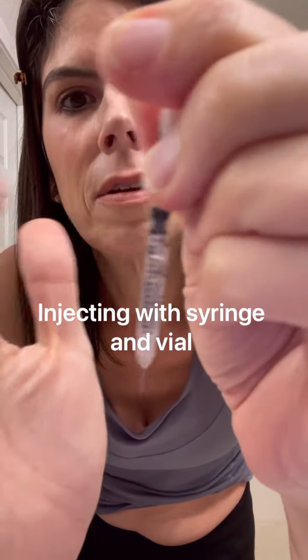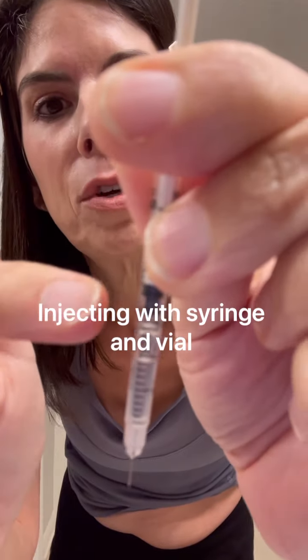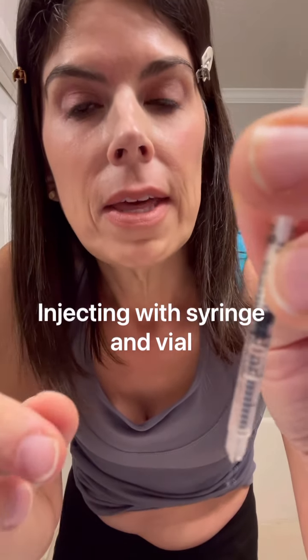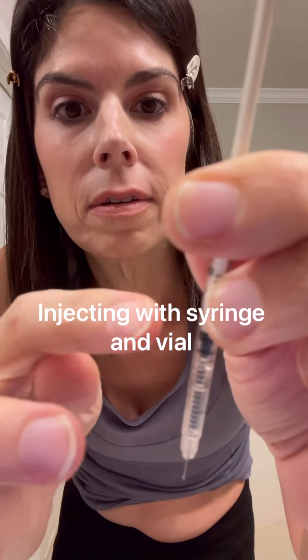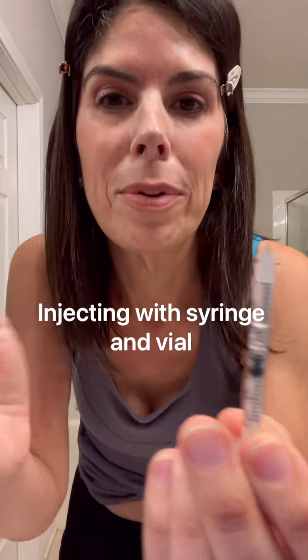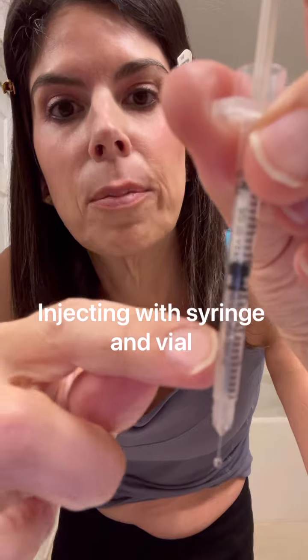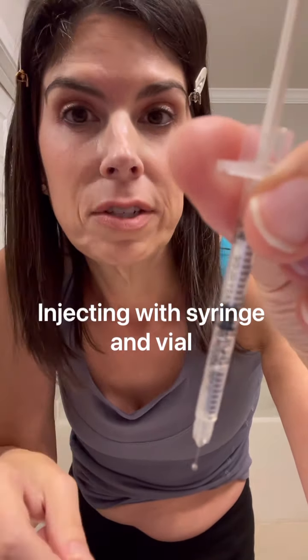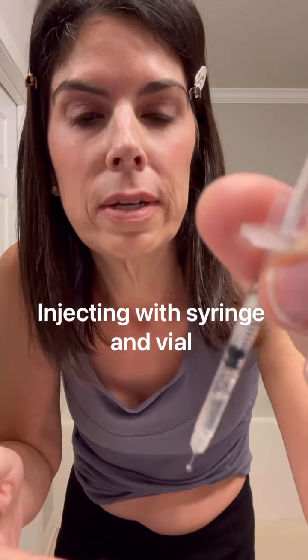Here's a pro tip: if you get the air bubble down toward the plunger end, that last little bit of air will actually propel the rest of your medicine in and won't hurt you, as long as you're injecting into fat. If you turn the syringe upside down, the air floats to the top, which doesn't help. Keep the needle pointing down — medicine goes in first, air follows and helps push everything out. That's more of an advanced technique.